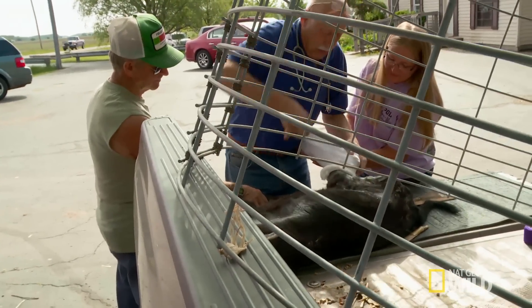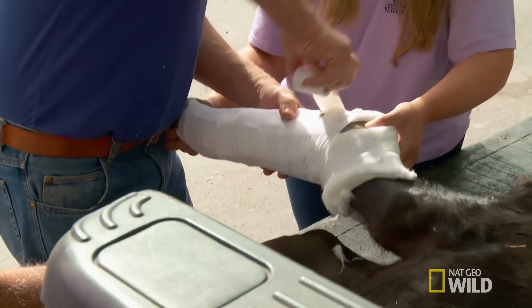They grow so fast that the cast can actually expand with their growth, and in about three weeks that bone is healed enough that the calf can walk on it. When he starts walking without a limp, almost, just cut it off.